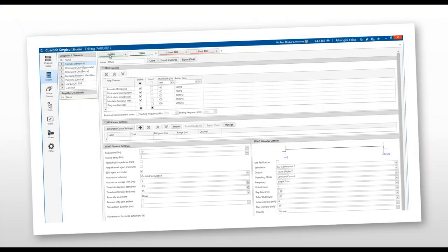In the mode settings, you can have spontaneous EMG, triggered EMG, left hand, and right hand. For triggered EMG, all five muscles are included: frontalis for the temporal branch, orbicularis oculi for the zygomatic, orbicularis oris or nasalis for the buccal, mentalis for the marginal mandibular branch, and platysma for the cervical branch. Threshold starting at 100 µV is acceptable; if responses are very small, you can lower to 25–50 µV. Sweep is 1.5 ms. ESU reject and mute should be on to reject bovie artifact. Auto-store can be set to valid stimulation to capture all stimulations.